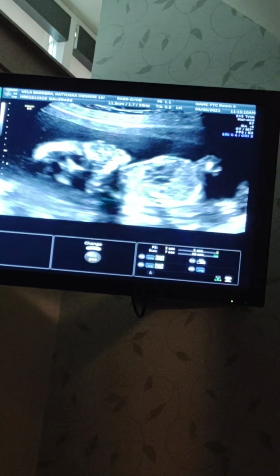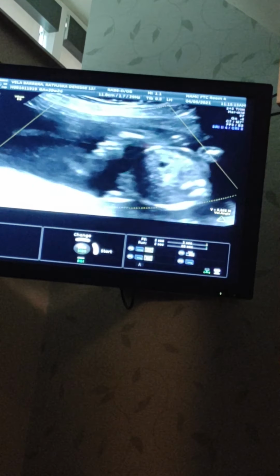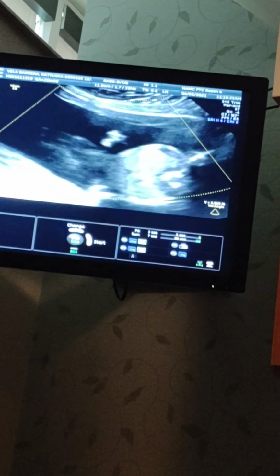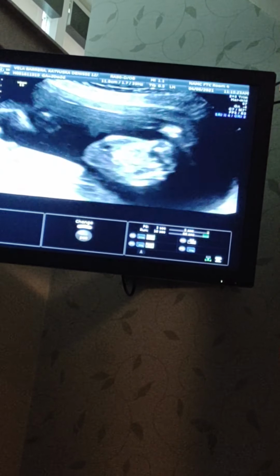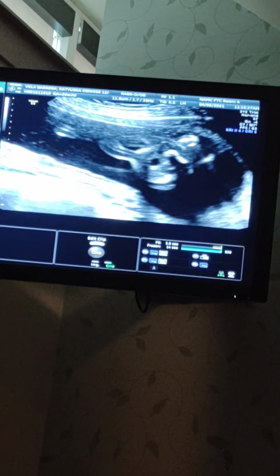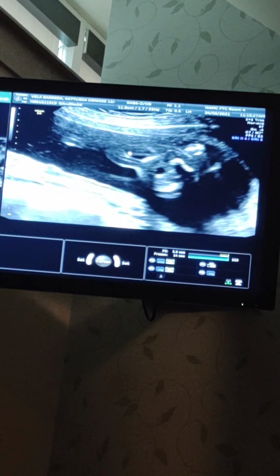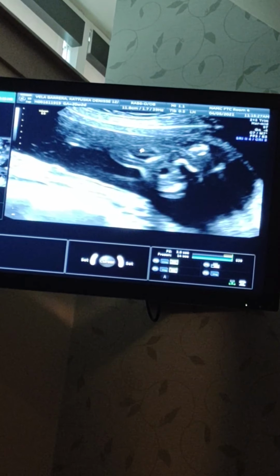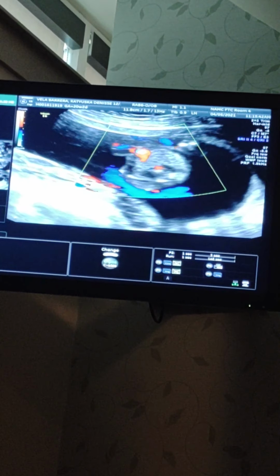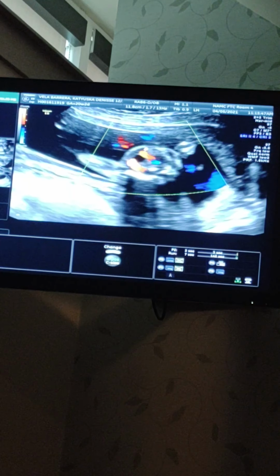There's the profile again. Is he turning or she? A lot of rolling around here. I'm trying to get a profile, but there's the belly. There's the bladder. That little black dot, that's baby's bladder. And that's where the cord goes in the front of the belly here. This is the umbilical cord insertion. If you put color Doppler to it, you can outline the blood flow going to the baby. Goes in by the baby's bladder there. Yeah, it's pretty cool.